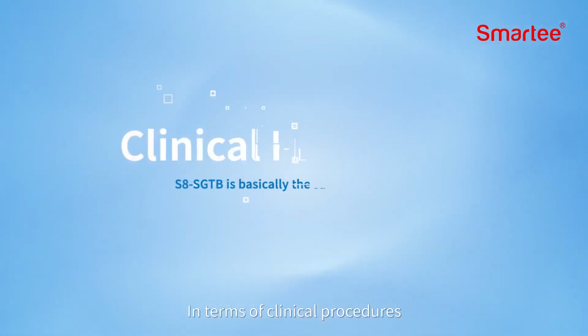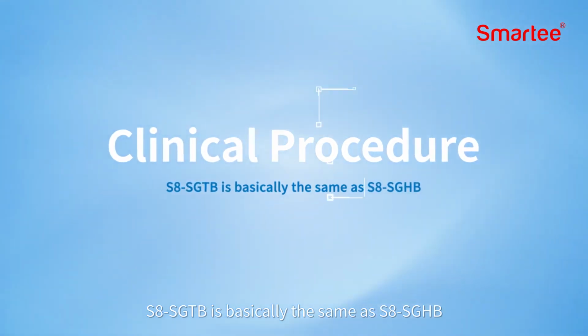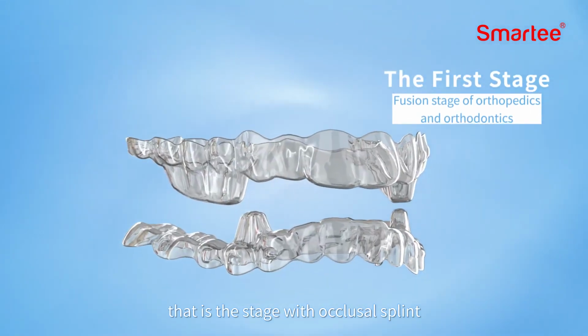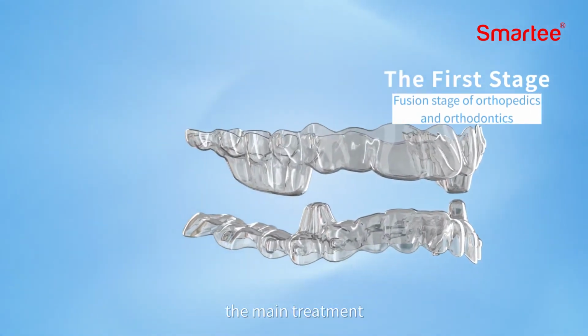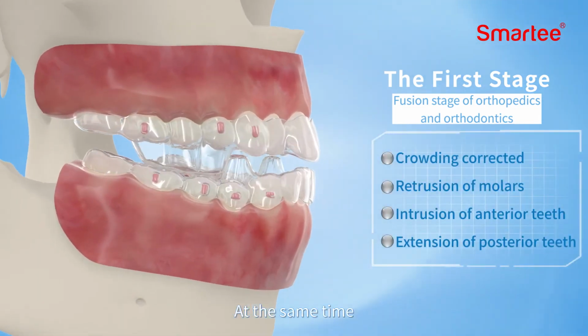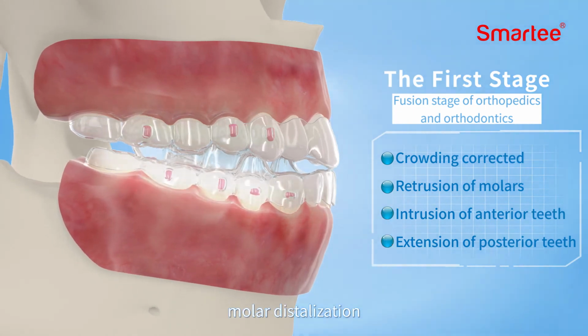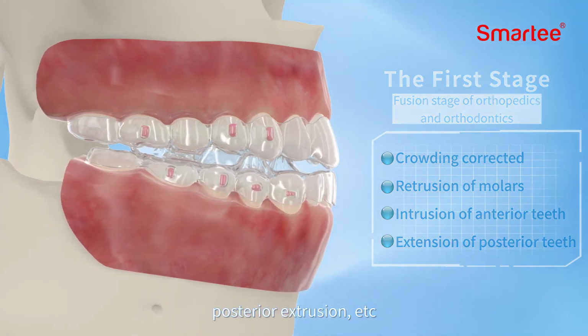In terms of clinical procedures, S8 SGTB is basically the same as S8 SGHB. The first stage, that is the stage with the occlusal splint or locking appliances, the main treatment is mandibular repositioning and orthopedics. At the same time, orthodontic treatments such as crowding correction, molar distalization, anterior intrusion, posterior extrusion, etc.